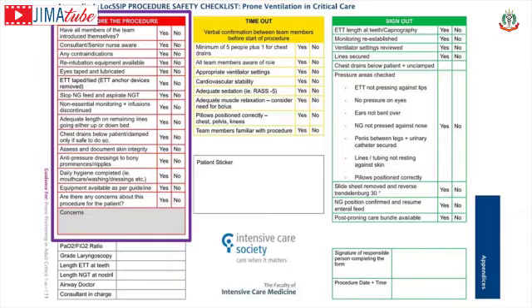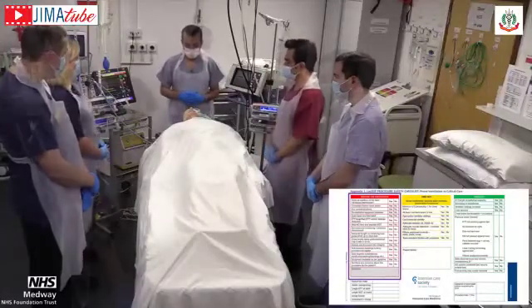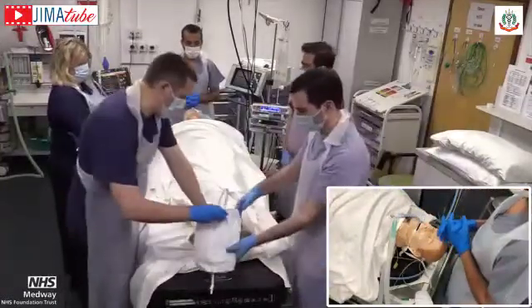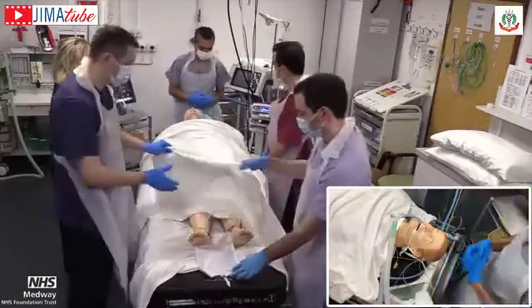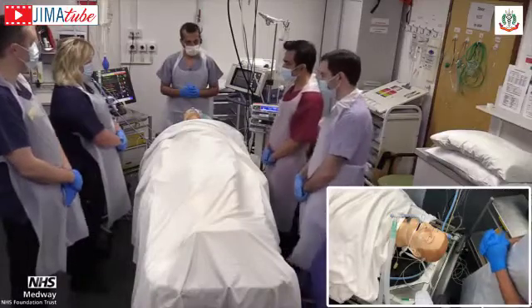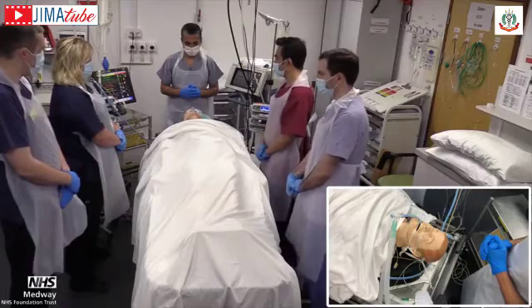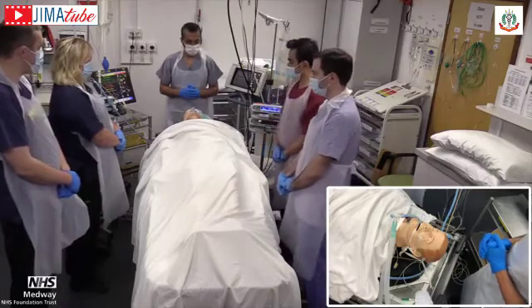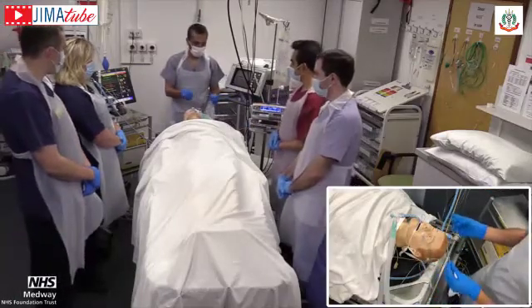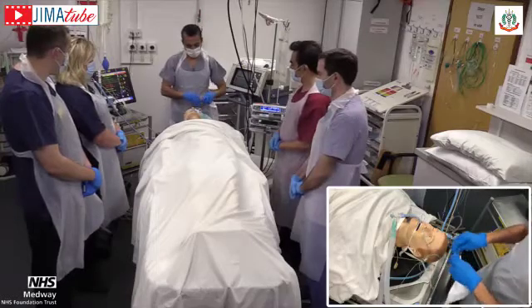So Vipul? Yeah, hello. Make sure you have the checklist open with you before starting the proning session. During this time, ensure all team members are allocated roles and check for any contraindications. The airway trolley is to be kept nearby, the endotracheal tube to be secured, NG feeding to be stopped and the NG tube to be aspirated. Enough line slack is to be ensured, and pressure areas to be taken care of. Team members will ensure daily hygiene including mouth care or washing are completed.